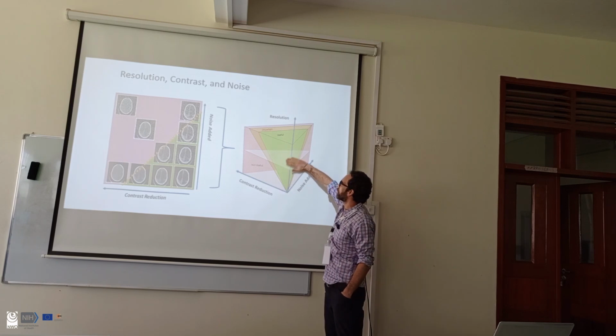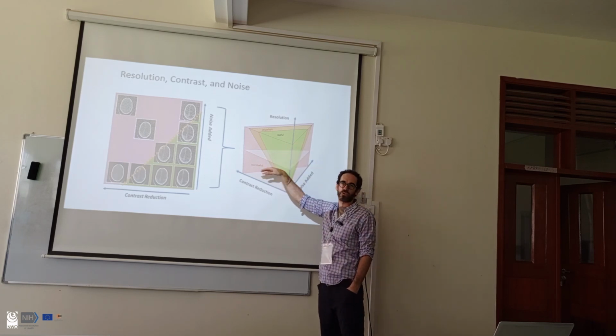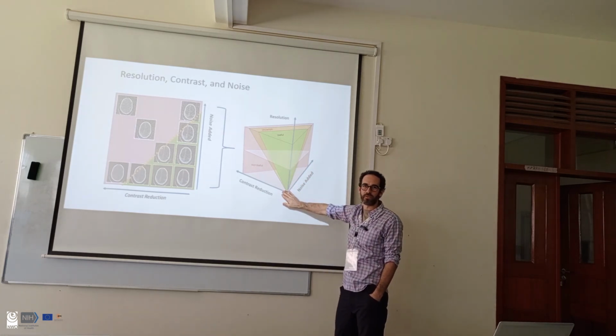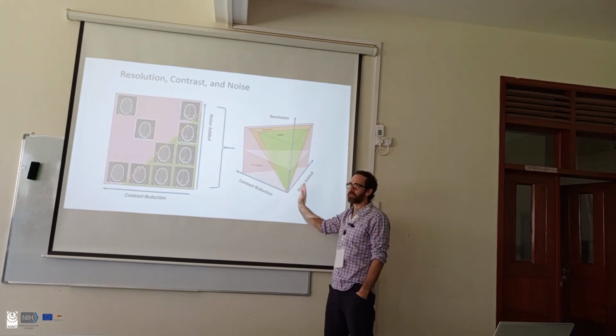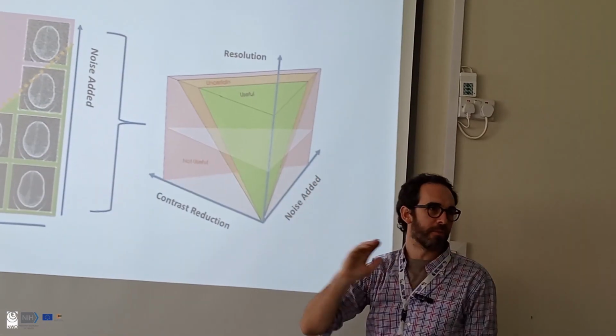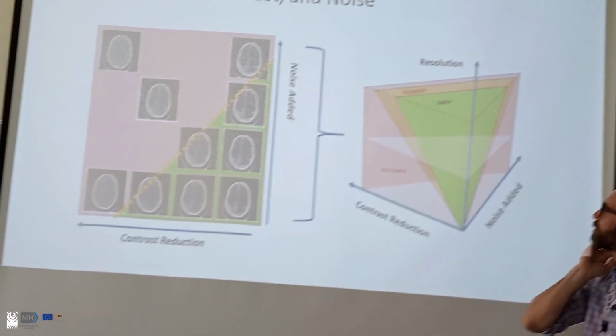Right? As resolution increases, we can stand a little less contrast and a little more noise, but we're going to be severely limited as we reduce our resolution. And then there's going to be a whole lot of combinations that are just not useful, and probably an area in the middle that we're not really sure about, right?